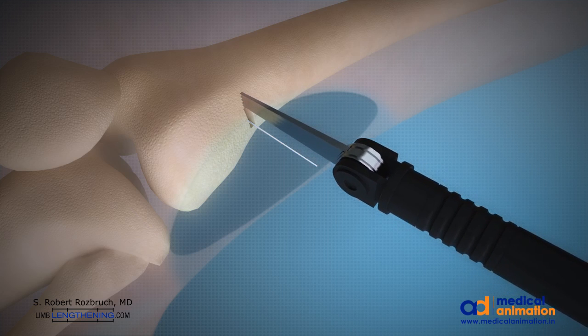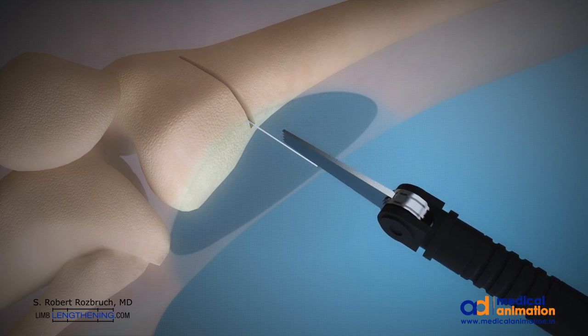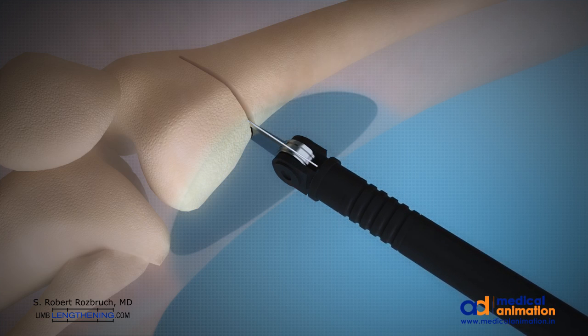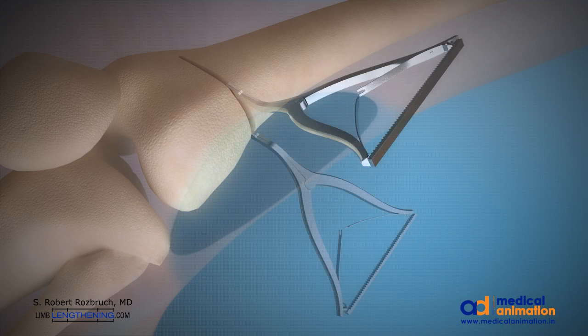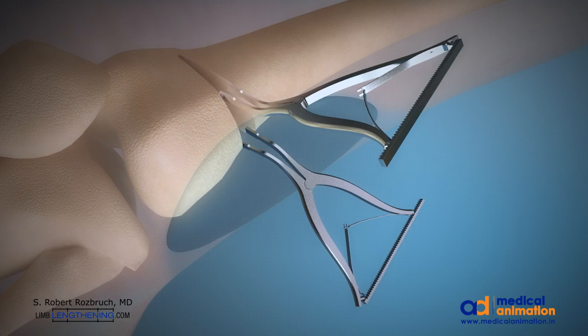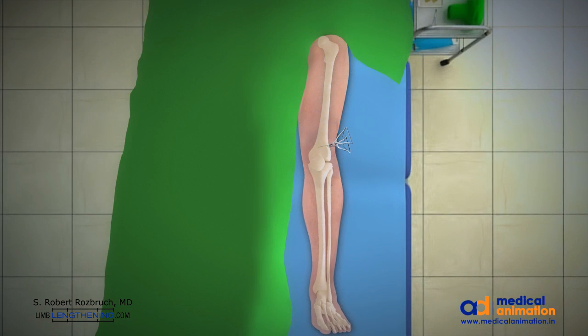Retractors are placed to protect soft tissues. Care is taken to avoid cutting the medial cortex to keep the osteotomy stable. Laminar spreaders are then used to distract and open the osteotomy on the lateral side based on the preoperative templating.